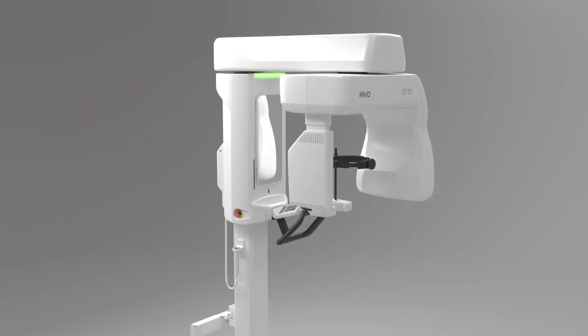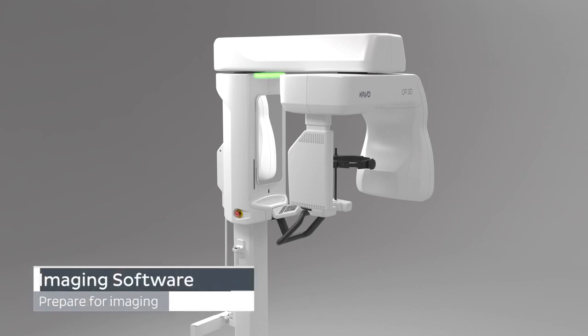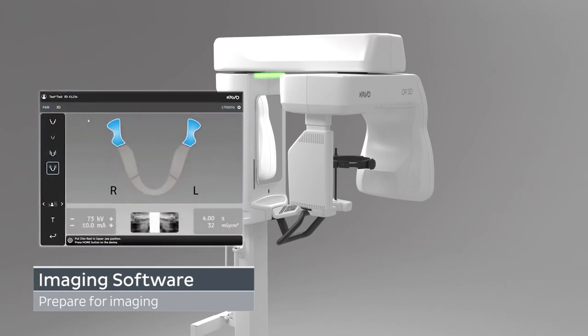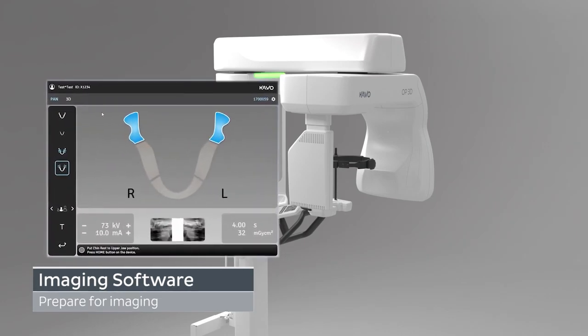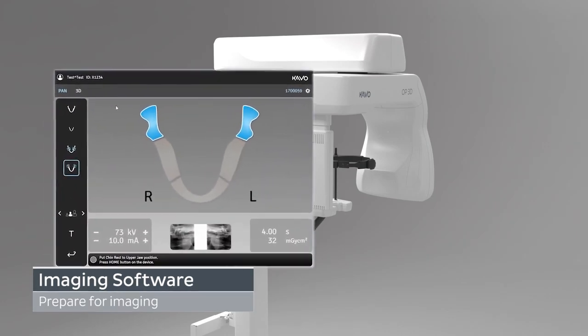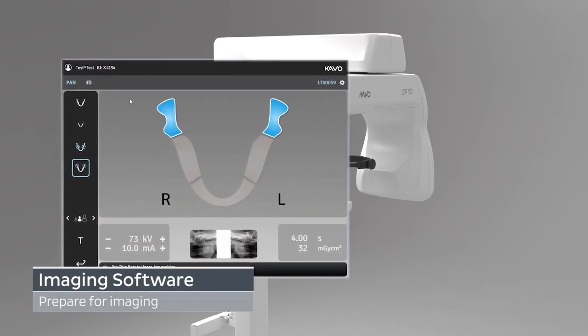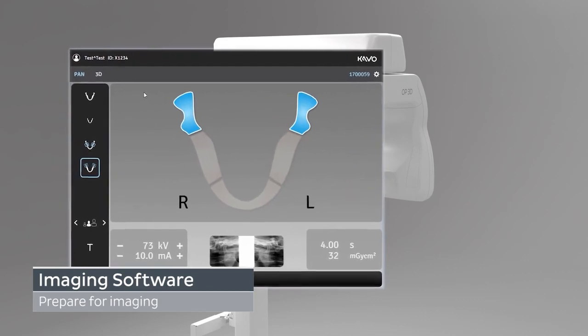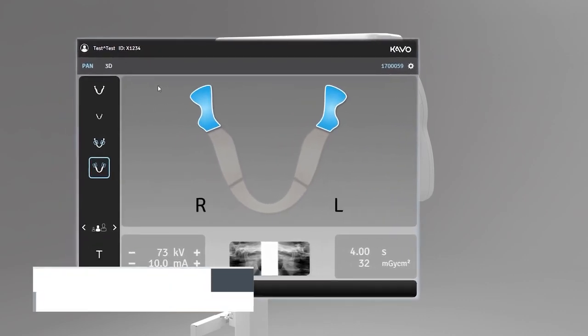Start by opening your dental imaging software. Select the patient for examination and select the device to establish a connection. The device graphical user interface opens on the workstation when the connection to the device has been established.